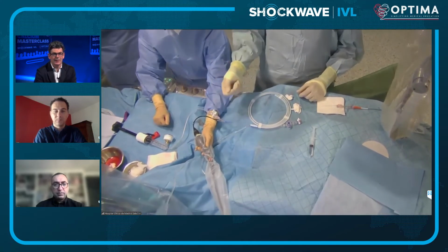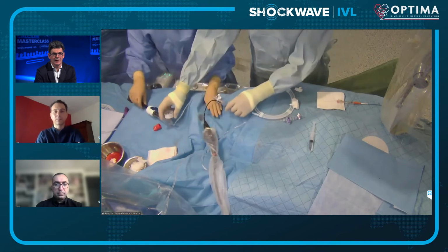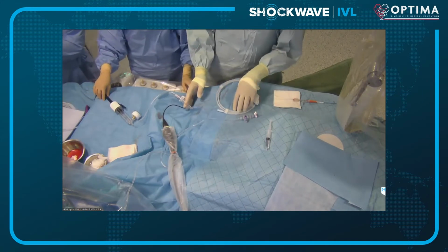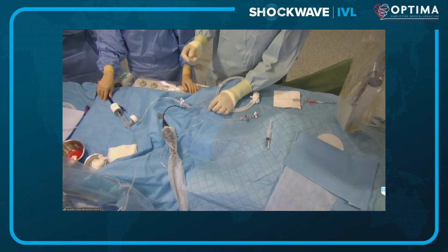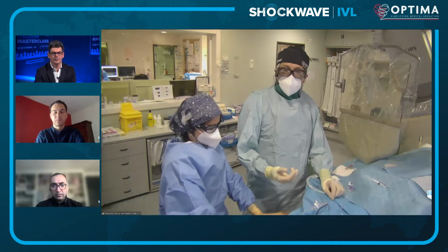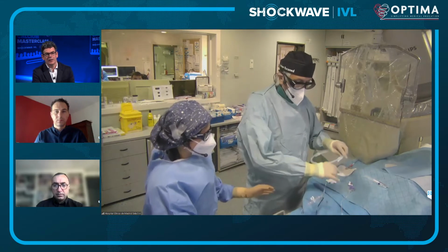You can see that Nieves, perhaps you can plug it and unplug it again, is connecting now the power source. This is very simple because it has a magnet. So it connects very nicely. Before that, what we did is we prepped the balloon properly. It's very important that you debubble the balloon a lot. If you have air left in your balloon, that will dissipate the energy and the delivery of energy will not be as effective. Even sometimes, and perhaps we'll do it in this case, because you generate CO2 inside the balloon as a consequence of the shock waves, you have to debubble the balloon over the procedure. But it's really important. So we did several cycles of deflation, just to make sure that there is no air inside the balloon.